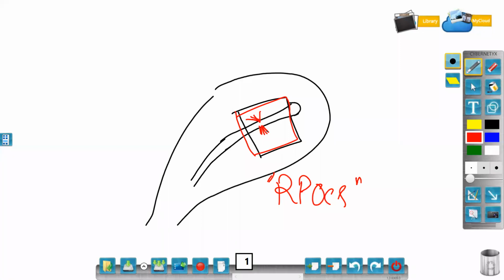It is not in that slice, but your color is telling you, doctor, there is a vascular area in this specific area. It means that retained products are there. So despite non-visualization of RPOC, if you are seeing a hypervascular area, then it is RPOC. This way you can differentiate between the two.